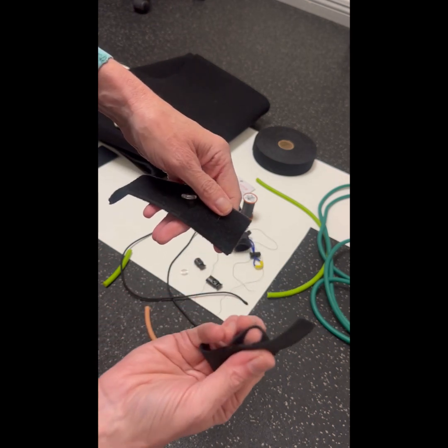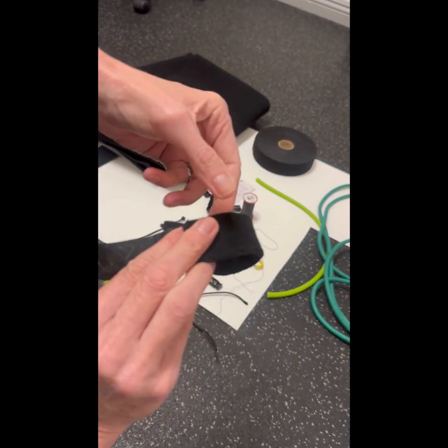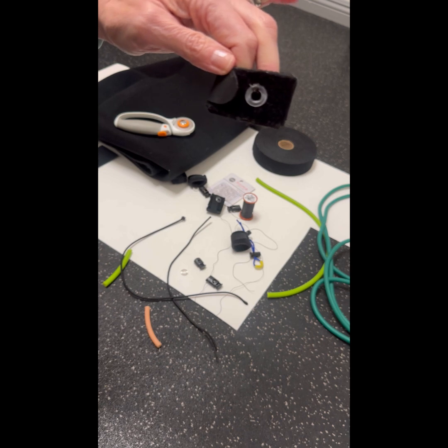I'm now going to use a piece of hook and loop — that's what it's called if it's not the Velcro brand — hook and loop, to be able to bring it around and attach it so that it can become a cuff that goes above the hock.